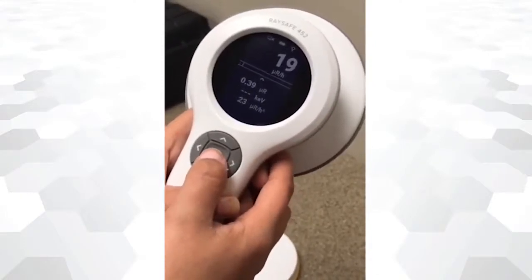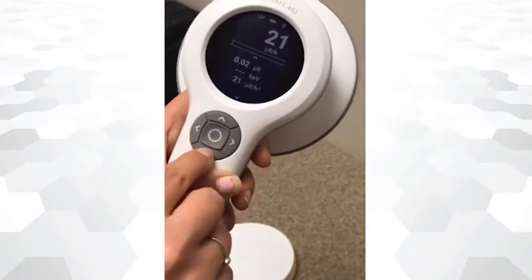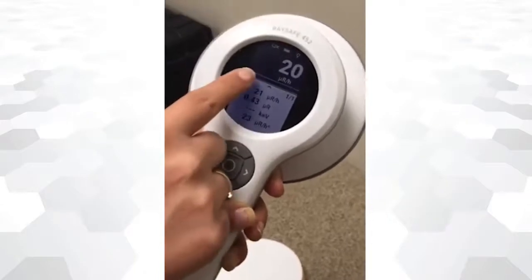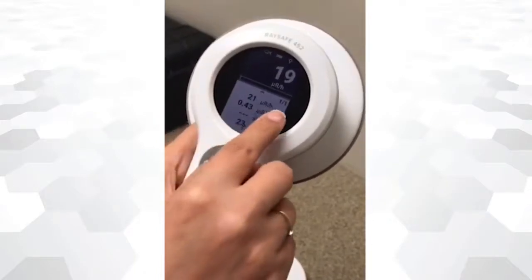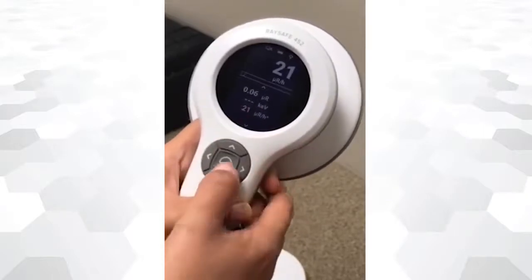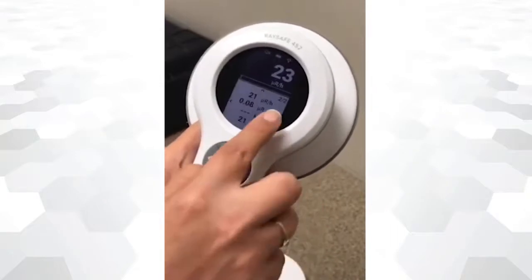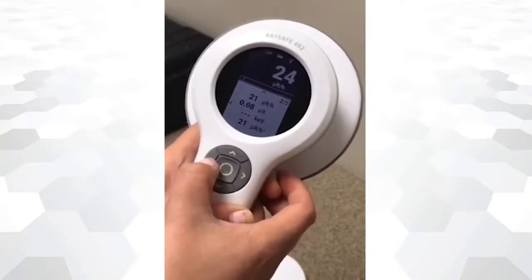To store a measurement, press the center button. The device records a log of the dose rate or count rate with a 1-second resolution from power on to power off. If you want to define the beginning of a new measurement, press the center button. The readings on the screen are also stored, and an arrow button will appear at the bottom to access the stored measurements while powered on.